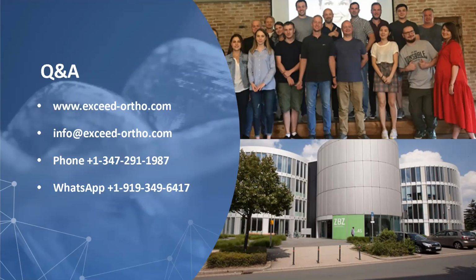So I will tell the technician, okay, overcorrect, do 17 degrees of movement or do 20 degrees of movement. I'm actually requesting for more. So what can I do? And this is something that you can also plan in your cases. Let's say that what you want to overcorrect is the rotation, or what you want to correct is the intrusion. So I will tell the technician, okay, go ahead, give me that ideal position, that final perfect position that I want. And after that position, begin doing more torque, or begin doing more intrusion, or begin doing more rotation.